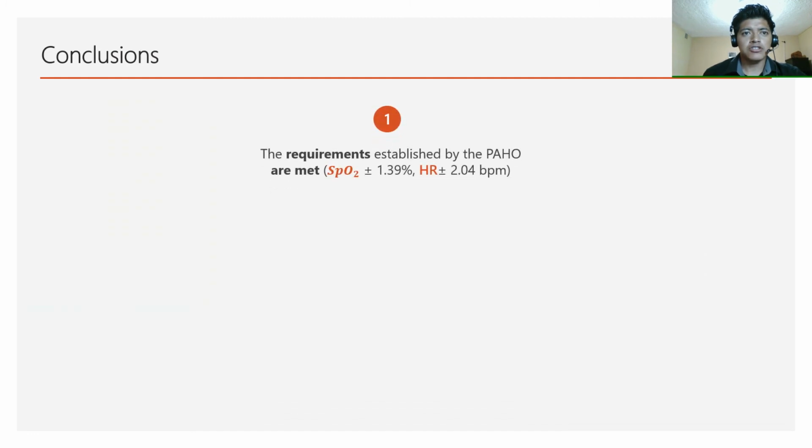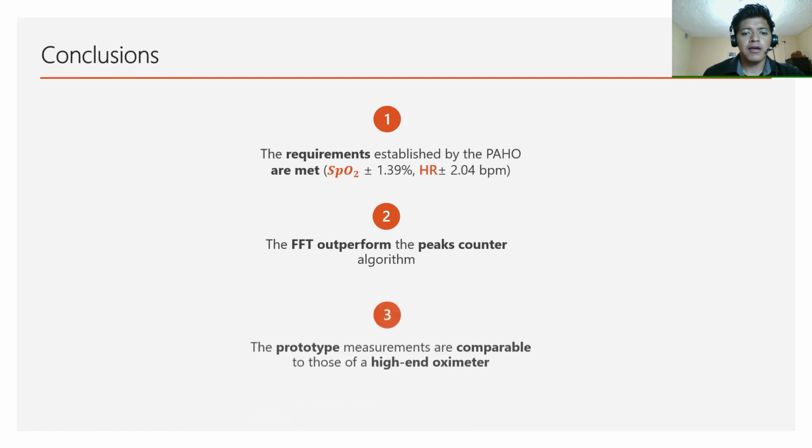So, in conclusion, the prototype meets the requirements established by the Pan American Health Organization for pulse oximeters. The FFT outperforms the peak counter algorithms for noisy PPG signals. And finally, the prototype measurements are comparable to those of a high-end commercial oximeter. However, further research must be done.